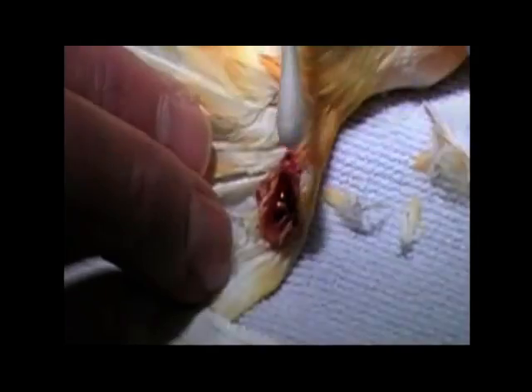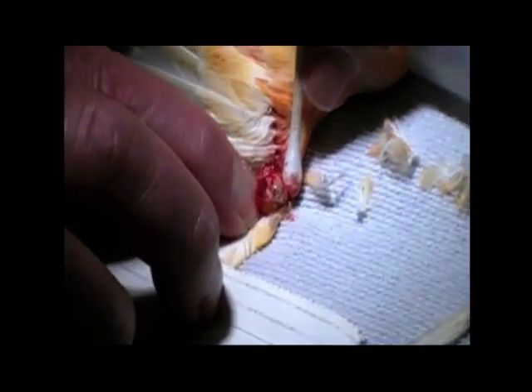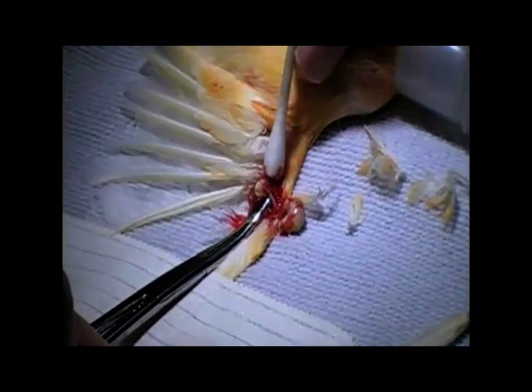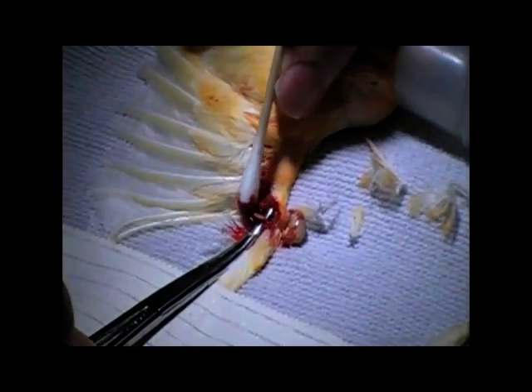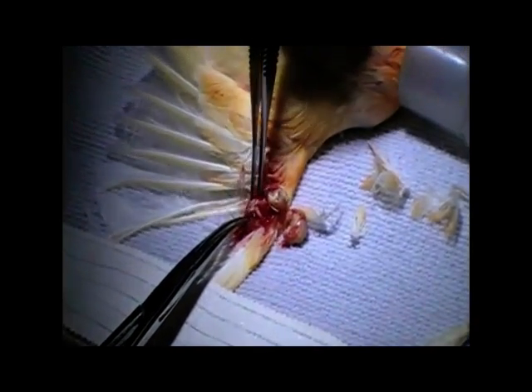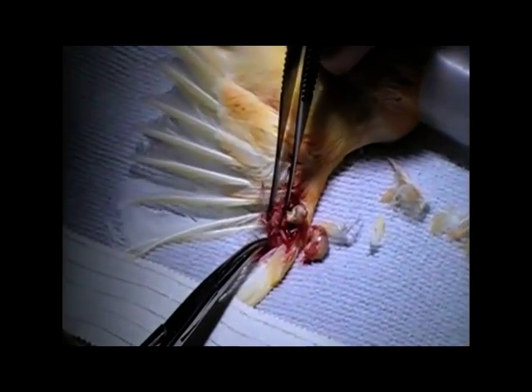I'll make an incision to expose this cyst. This is a bigger cyst. I'll need to kind of get that expressed out. I'm just going to get this one expelled and there's another one adjacent to it. That's very attached. There we go. I'm going to tease that out and get that all removed.